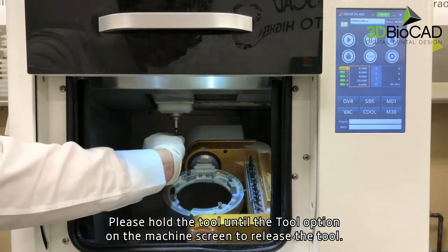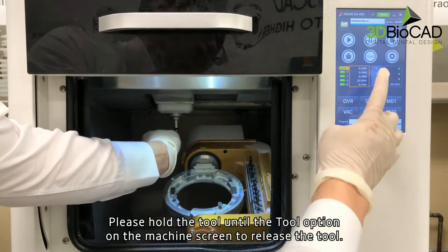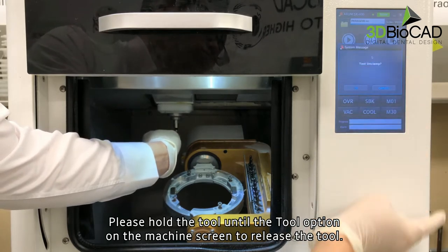Please hold the tool and select the tool option on the machine screen to release the tool.